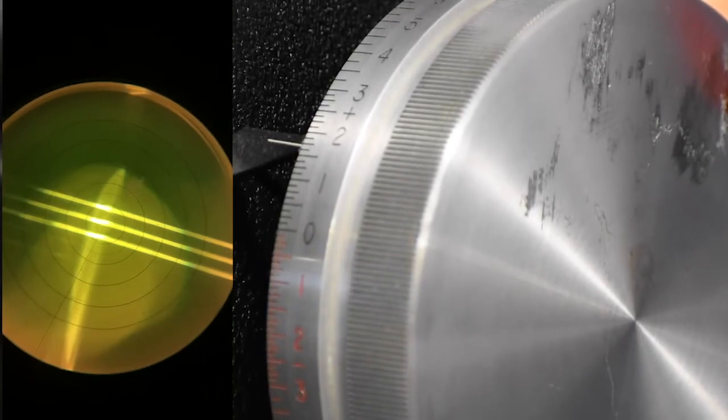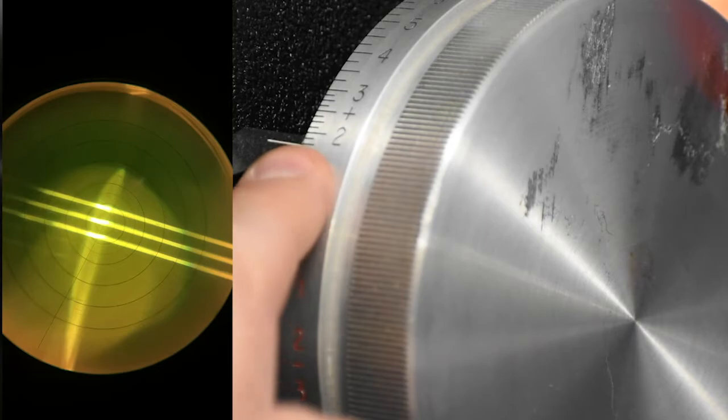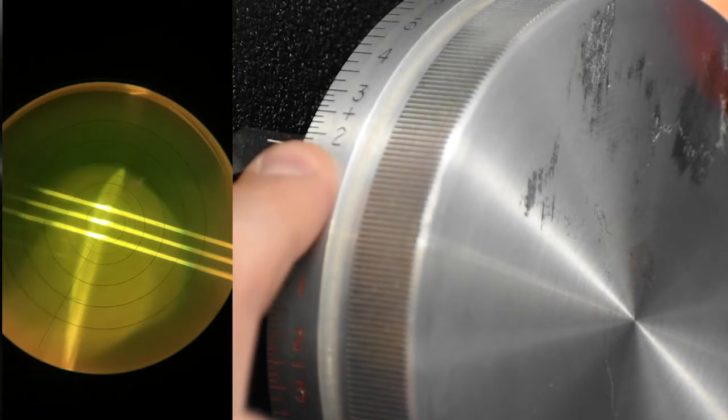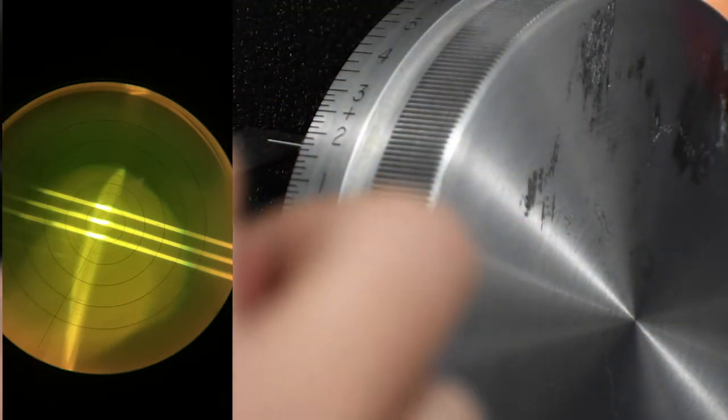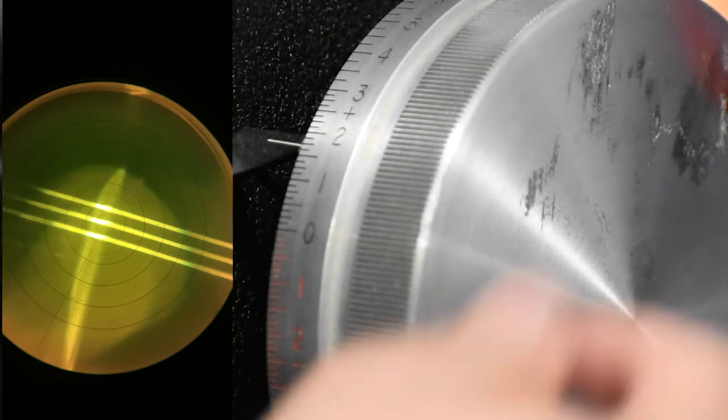Okay, now we're gonna go ahead and read the add power on this power wheel. This is the same prescription that we had gotten earlier, the plus 175 minus 225 at 006. So we're gonna start with the sphere power. So we had started at around 175, that's our sphere power. And we moved the lenses up to the center of the bifocal. So now we're gonna go ahead and read the add power to that bifocal.